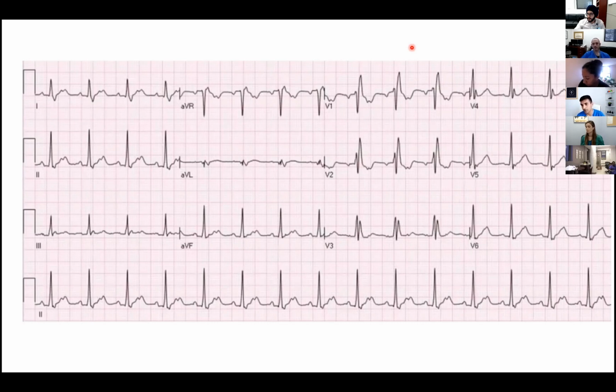Yes. So basically, one thing that suggests, and again, you can have very atypical forms of flutter and atrial tachycardia, sometimes impossible to differentiate. But in just a basic sense, your classic flutter circuit will generate an atrial rate of 250 to 350, around 300 usually, while atrial tachycardias are a little bit on the slower side. So if you look at this one, on any of these leads, this is around 200-ish, or a little bit faster than 200. So based on that rate, I would say more likely atrial tachycardia.